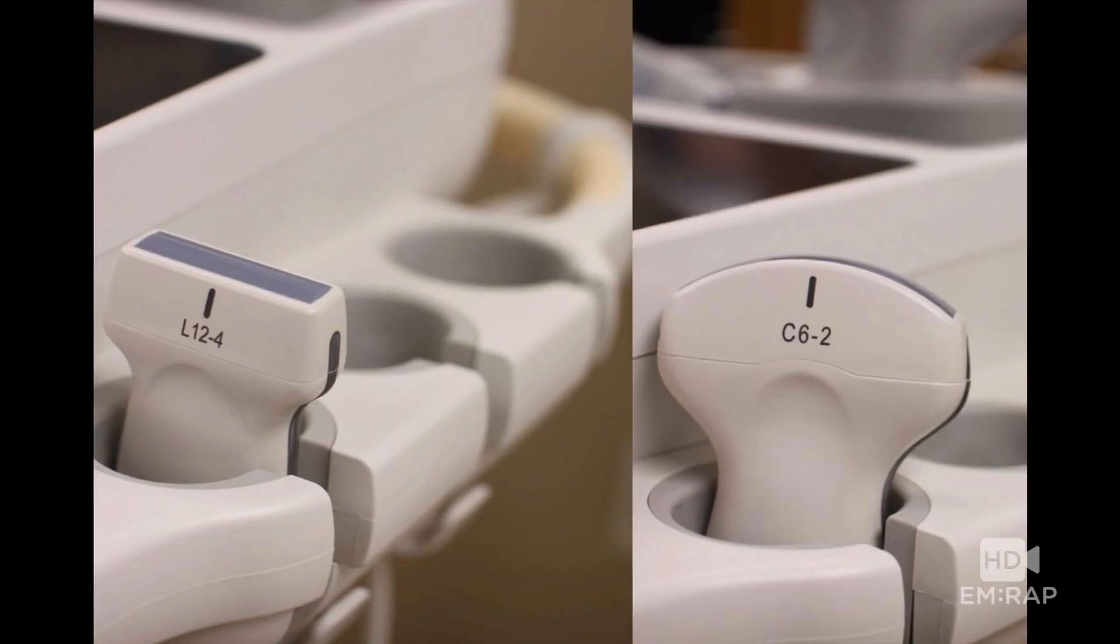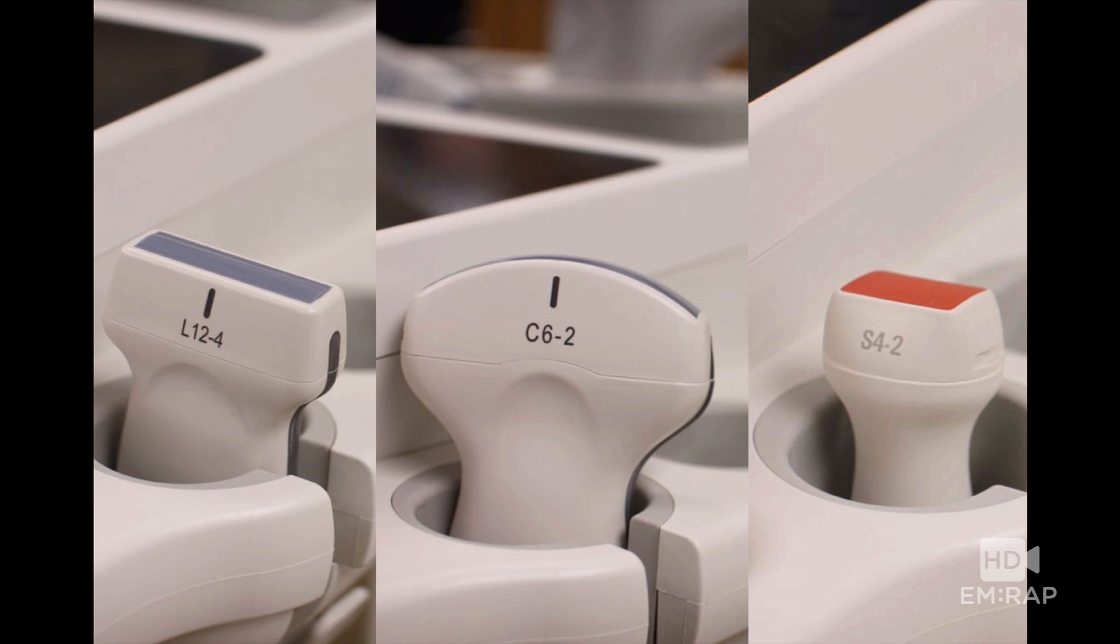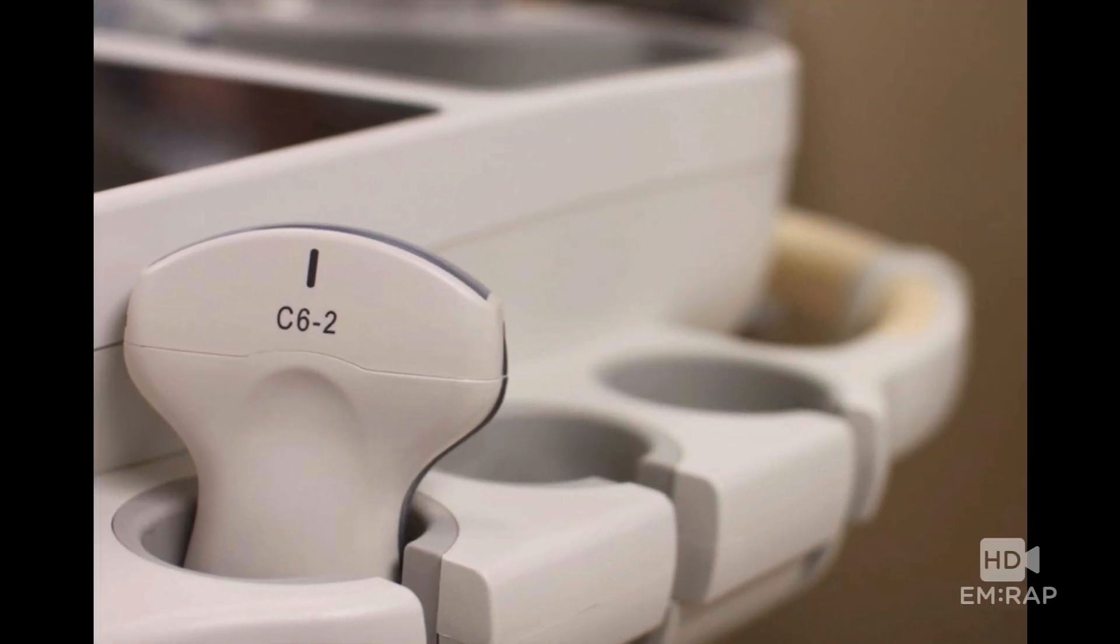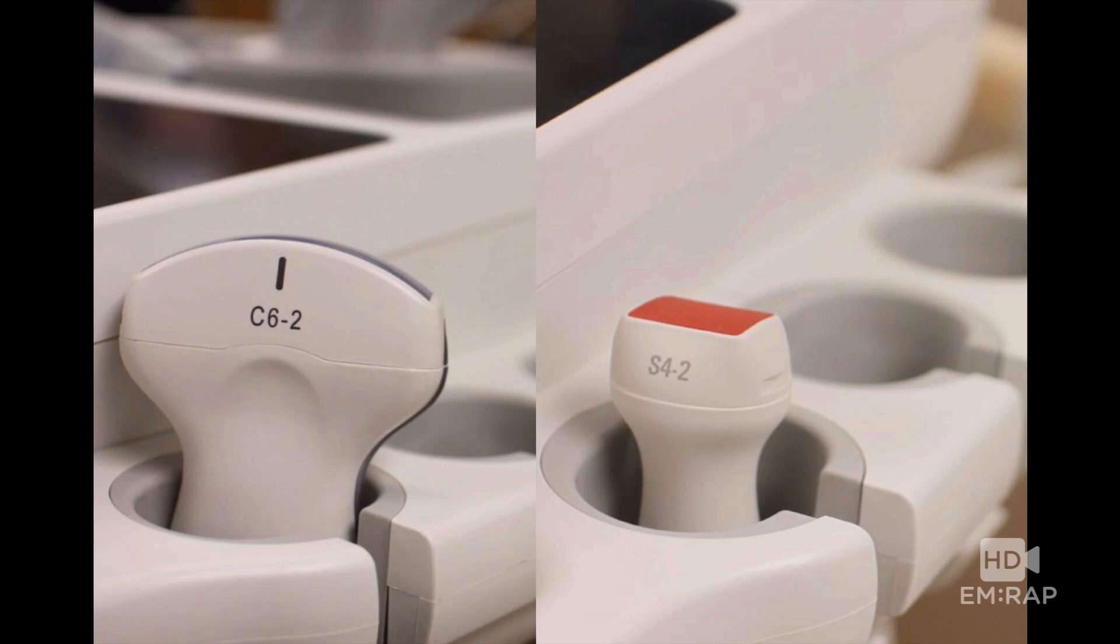For this exam, you can use any of the three main ultrasound transducers, but my favorite probe for this is going to be the curvilinear probe. If you don't have the curvilinear probe, the phase array will work just fine.